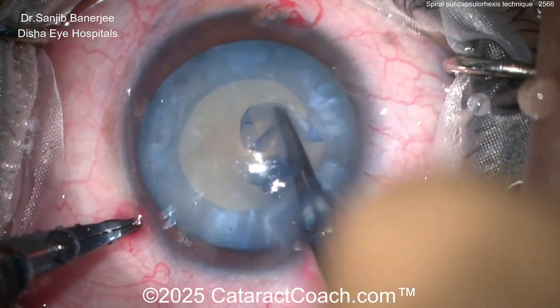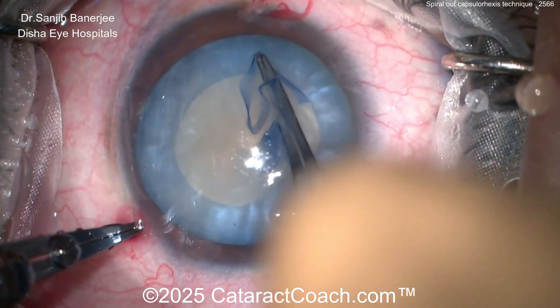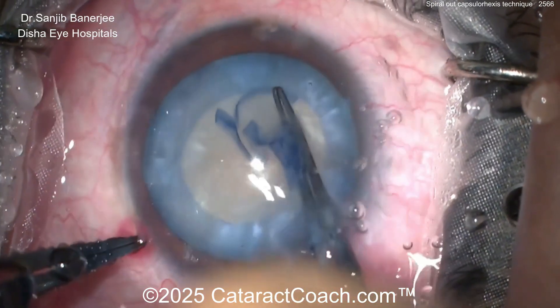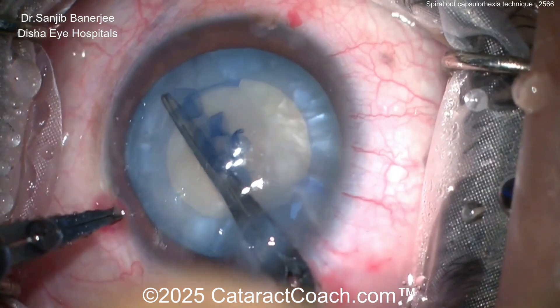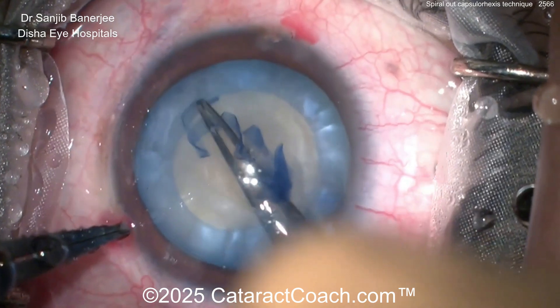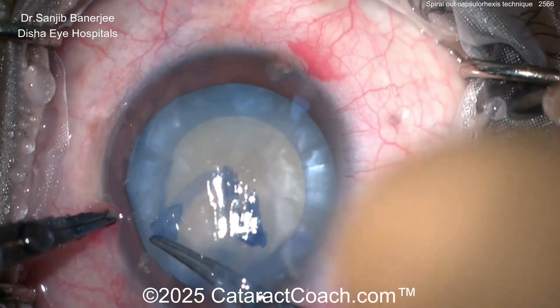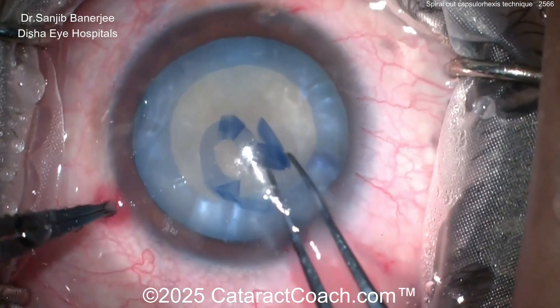I'm still impressed by that. Look at this — complete rhexis again, spiraling out more and more. This takes some control because look how thin that little strip is — it's like a millimeter thin, maybe even less. Beautiful technique, beautiful control — that looks fantastic. So the spiral-out technique; and again, as mentioned at the beginning, if it starts to run out, just quickly pull centrally, finish up that baby rhexis, decompress, and then do the second rhexis — the double rhexis technique.